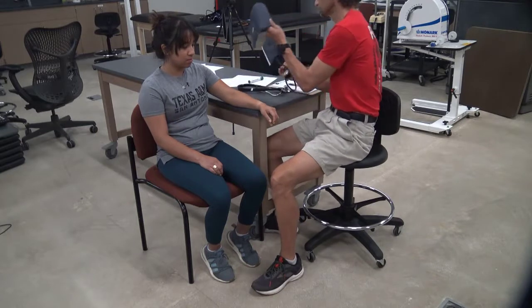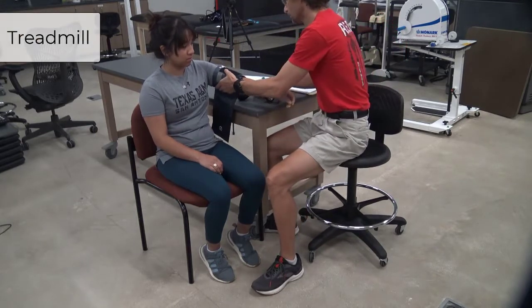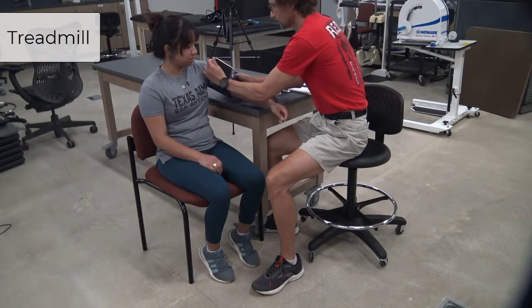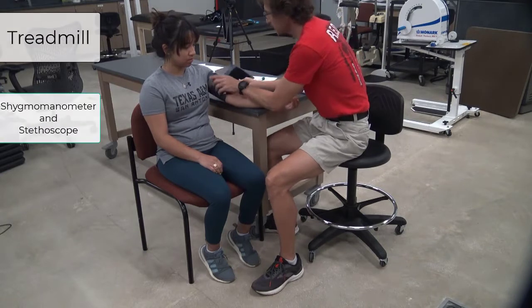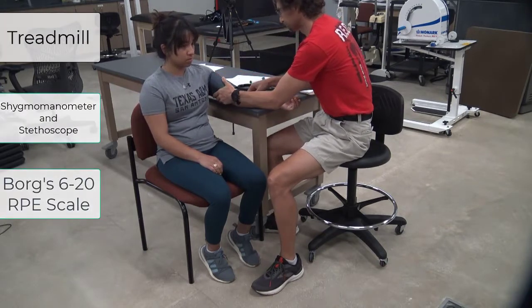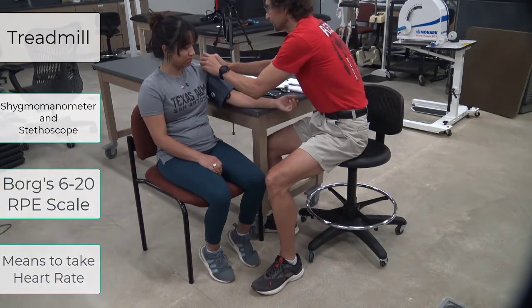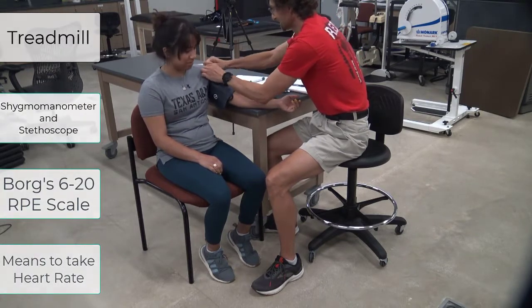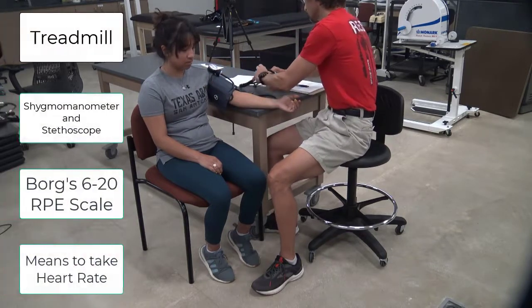For this test, you will need a motorized treadmill that can increase to a 14–16% grade and can increase speed to the tenth of a mile per hour, a blood pressure cuff, a rating of perceived exertion scale — typically the Borg 6–20 scale. While a heart rate monitor can be used, we will be taking heart rates manually. If using heart rate monitors, it's best to use one with a chest strap, since monitors that read from the wrist have yet to be validated.